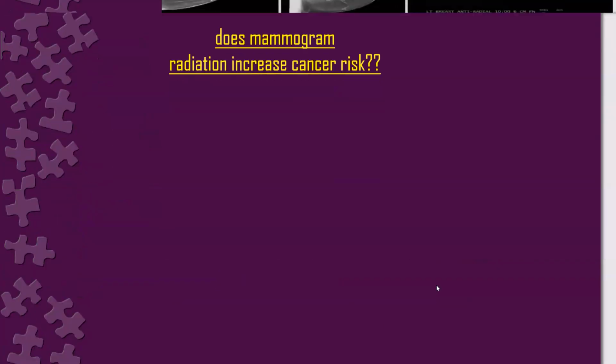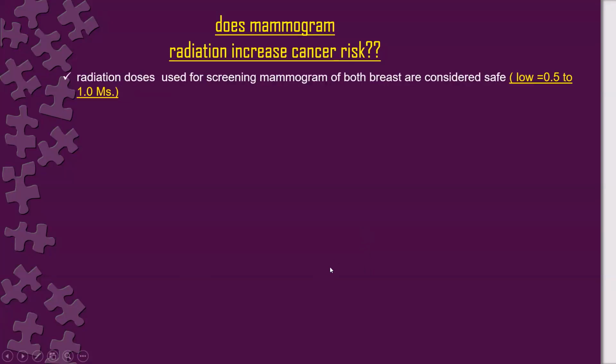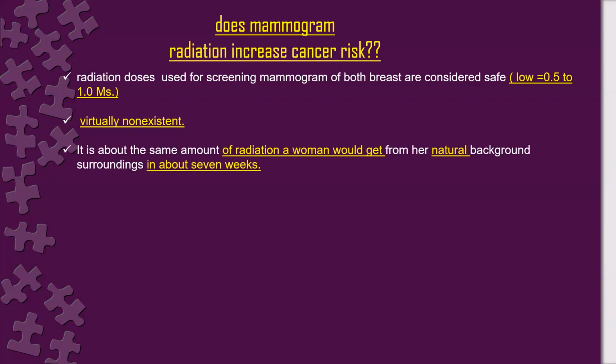Okay, so does mammography radiation increase cancer risk? Screening mammography, does it increase the cancer risk? Any idea? Radiation doses used for screening mammography of both breasts are considered safe. It is very small. It is virtually non-existent.